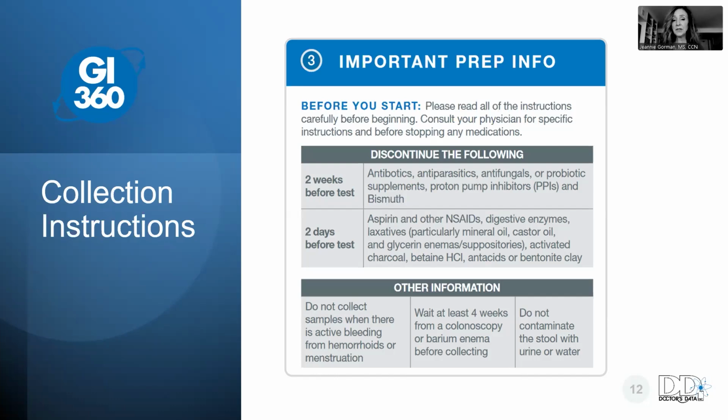2 days before the test, to avoid these false positives, come off of aspirin, NSAIDs, digestive enzymes, laxatives, of course, activated charcoal, betaine, antacids, etc.